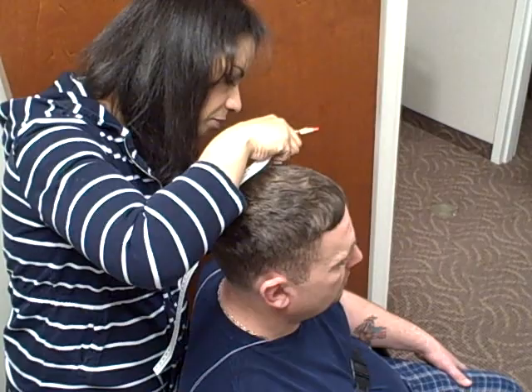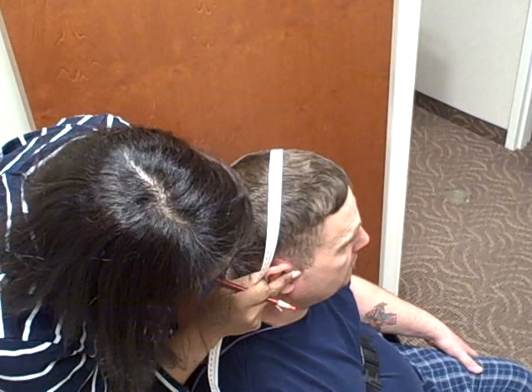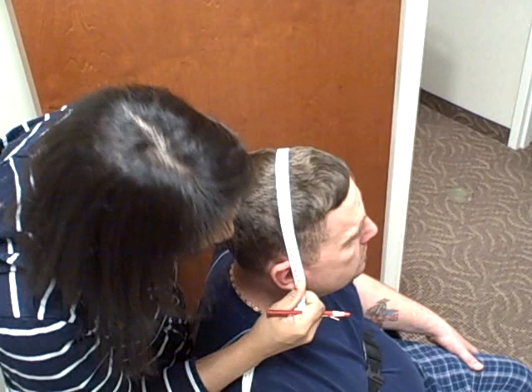Then I'm going to measure from pre-auricular to pre-auricular. If you're not quite sure where that's located, you can put your finger just about here — it's usually where the notch is. Ask the patient to open and close their jaw and you should be able to feel the opening and closing of the jaw.